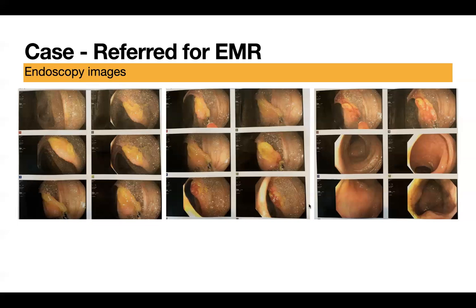Why don't I ask Sylvia to comment on what you see, and how do you go about dealing with this one? I think, well, I very much agree with the description by the previous speaker.